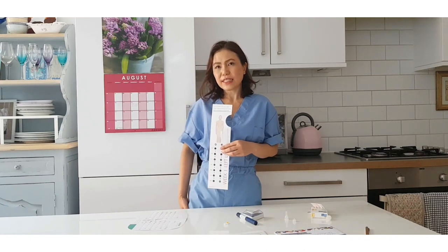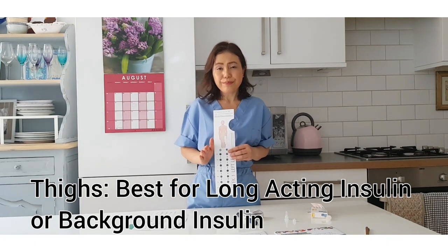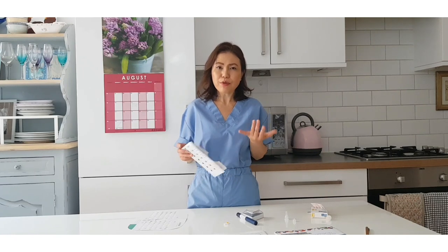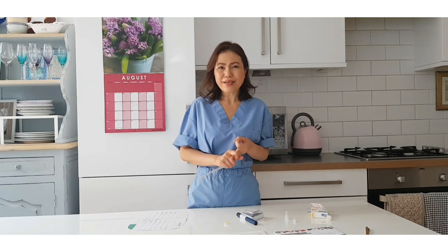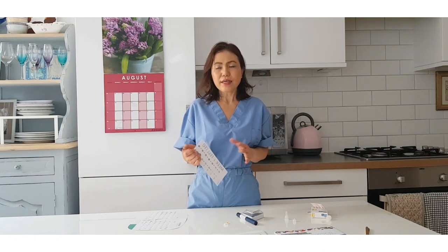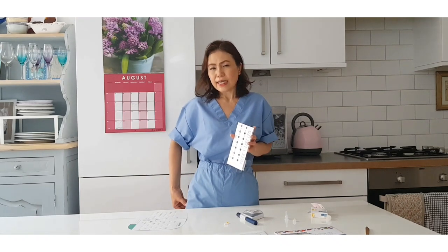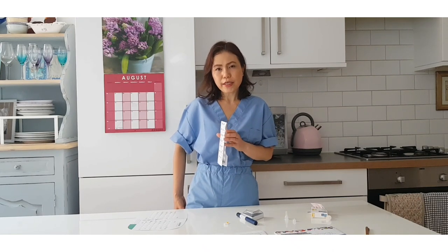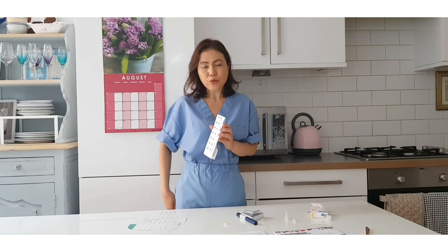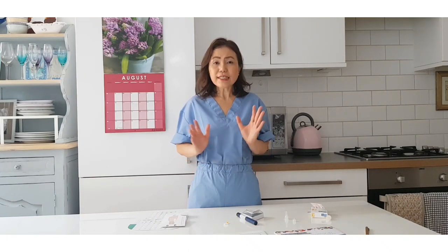For the thigh, I would advise using it if you are on long-acting insulin. There are a few names for long-acting insulin - the popular ones are Lantus, Abasaglar, Levemir, or Humulin I. Those are to be given in the thigh because we want the long-acting insulin to act slowly - we don't want it to be absorbed too quickly. For fast-acting or meal insulin, the tummy is advisable.